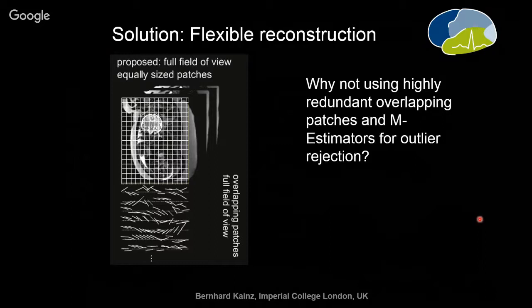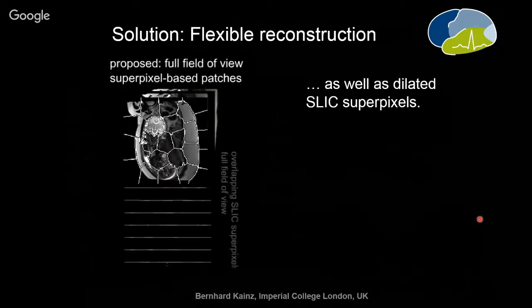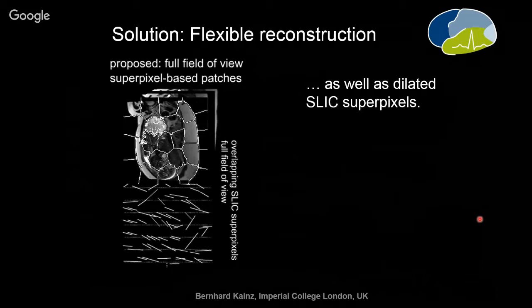whole uterus reconstructions. A more intelligent approach would be to already use semantically meaningful information, and there is quite a lot in the computer vision literature. So something like superpixels are quite good representatives of areas which seem to belong together. In fact, it's nothing else than a multi-level level set, but it turns out that these kinds of techniques work quite well to, first of all, reduce our redundancy a little bit again, and to get structures which are very likely to contain consistent information.